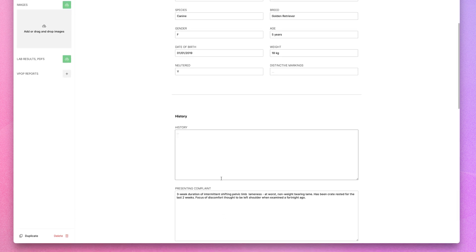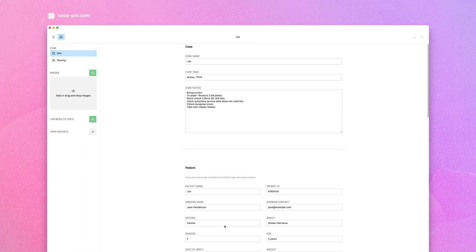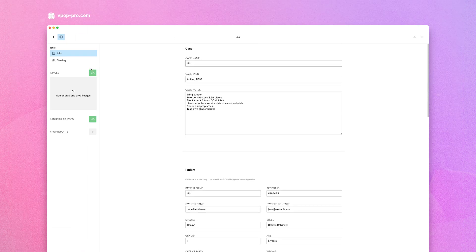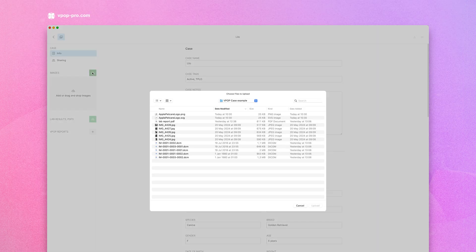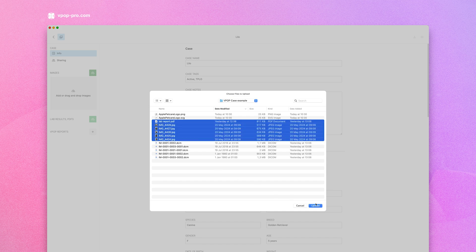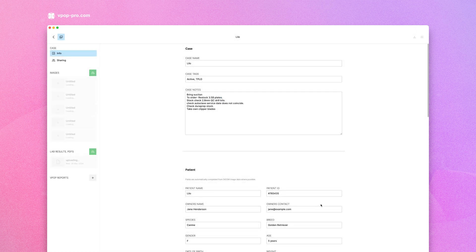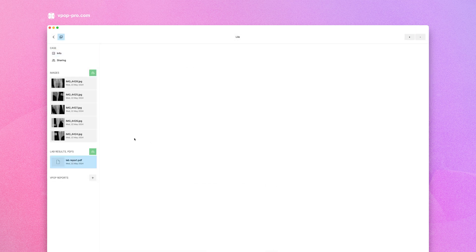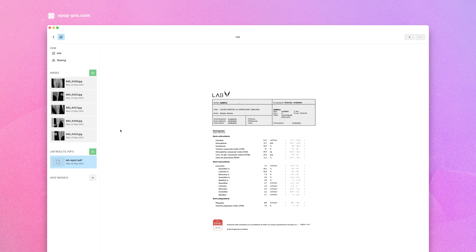Once you've entered the details, it's time to add the images. Click the Images Upload button to upload diagnostic images from your computer. You can select multiple files at once, saving you time, or drag and drop images into VPOP.